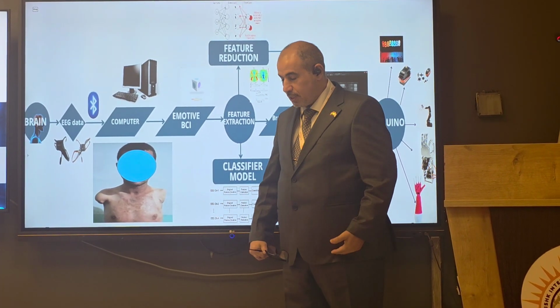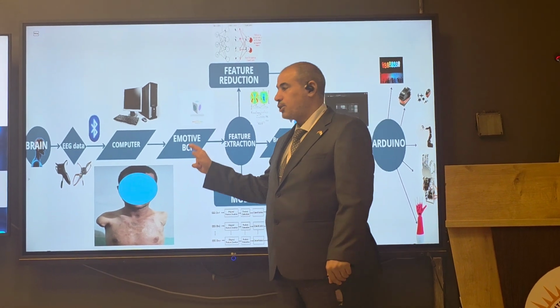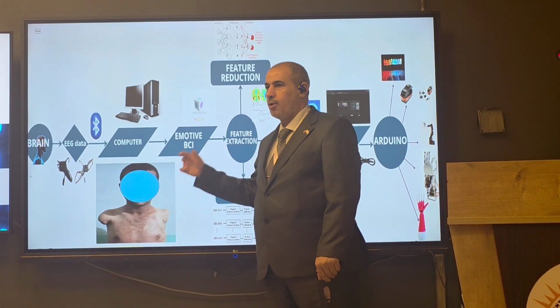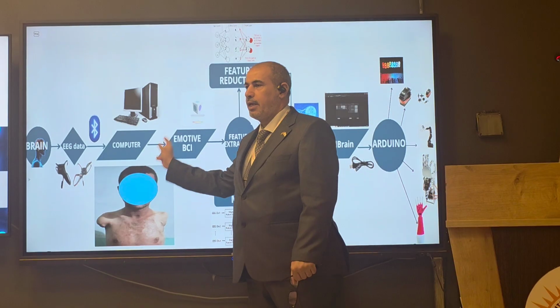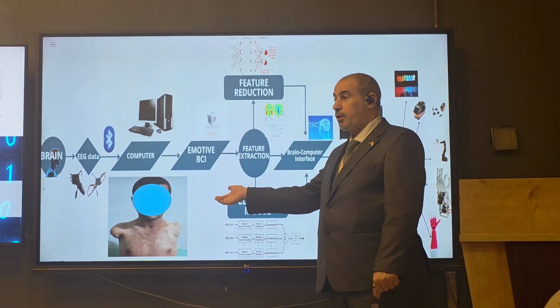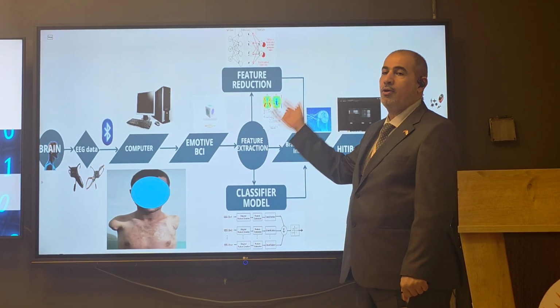Inshallah, next time we'll defend this case in our center to build upper limb and lower limb, inshallah, using brain EEG signal. Therefore, we transfer working for artificial limbs from EMG signal to EEG signal.